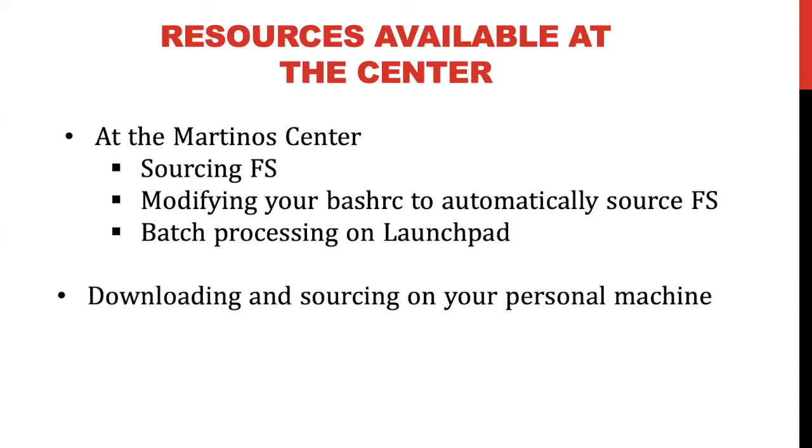And so, like I said, FreeSurfer is available to us at the Martinos Center. And this is where it gets tricky. If you're not super familiar with how to use a terminal, you're going to learn, and it will get better. I can say, as someone who did not use a terminal ever before I started this job, and now 2 years in, I'm super comfortable in it. And it didn't take me 2 years, which is exciting.